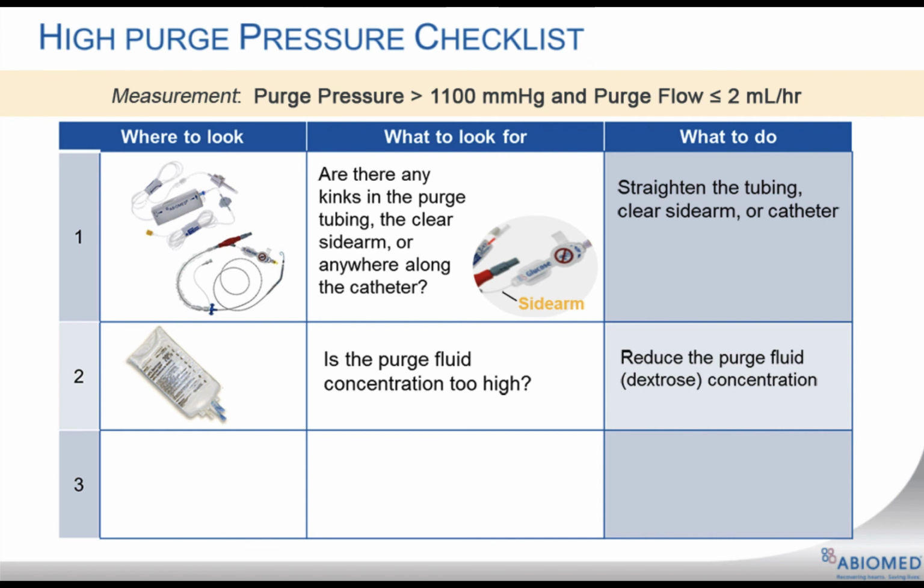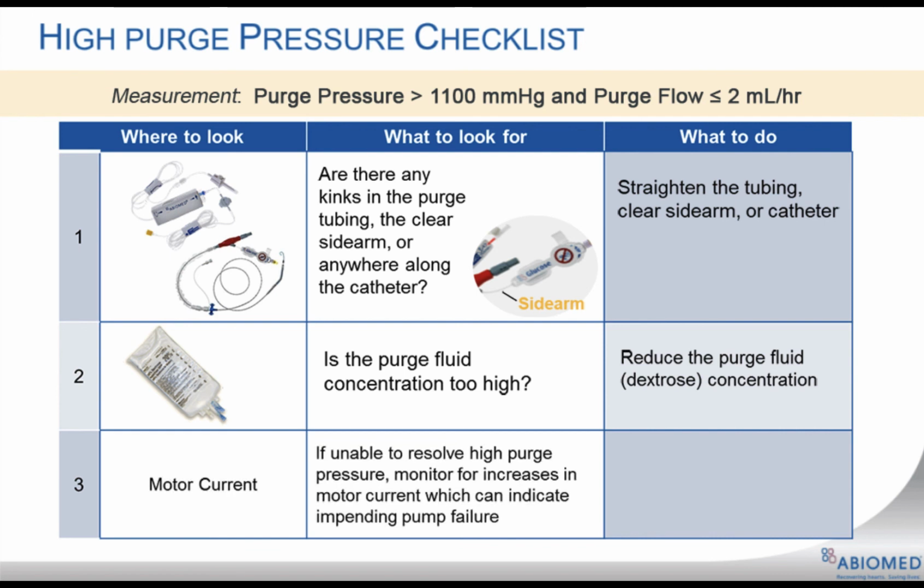If unable to resolve a high purge pressure alarm, monitor the motor current for increases, which can indicate impending pump failure.